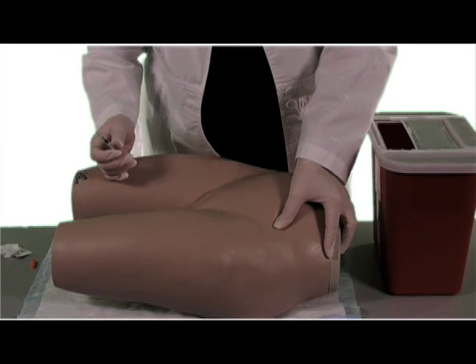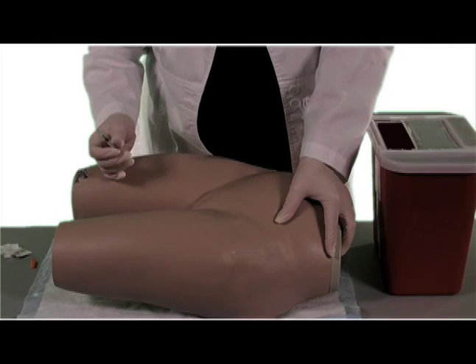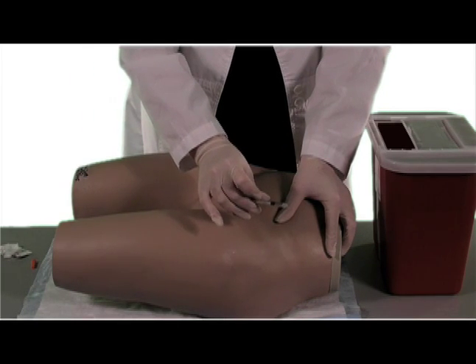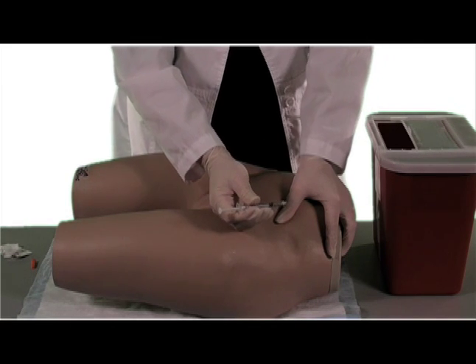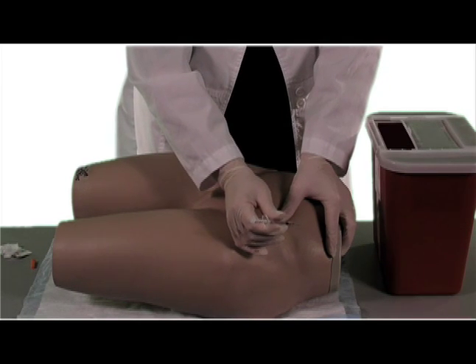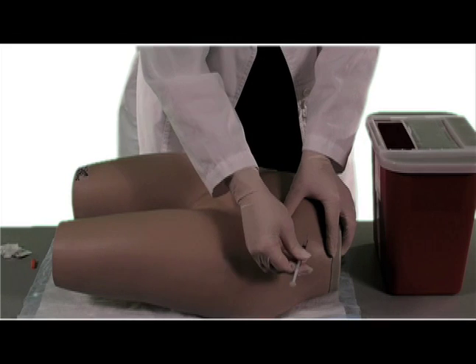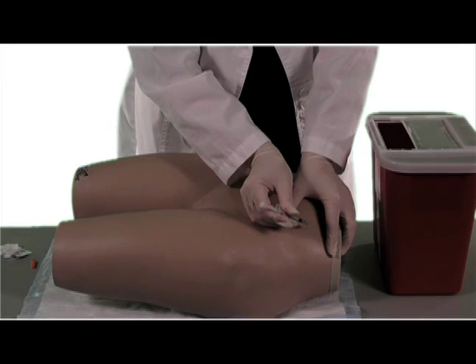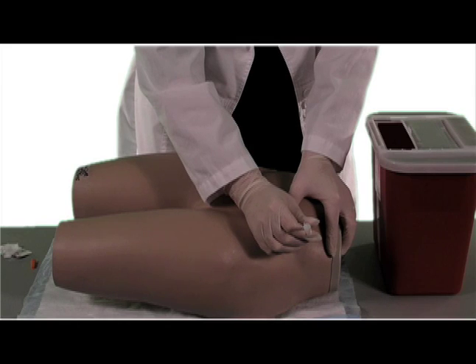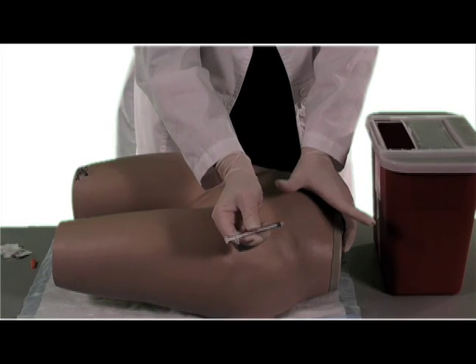You're going to pinch the skin. Instead of pulling it taut like you would for an IM injection, you actually pinch the skin up to get that subcutaneous tissue between your fingers. The bevel on the needle does not matter which way it's turned. There is no need to aspirate for this injection because there are no major arteries or veins in the subcutaneous tissue. Give the injection either at a 90 degree angle or at a 45. If you're giving it at a 45 degree angle, make sure you go parallel to the way your fingers are placed — not crosswise, because you could stick yourself. We're going to do a 90 degree angle. Throw it like a dart — in we go. Inject your medicine. Retract your needle, then let go of your pinch.